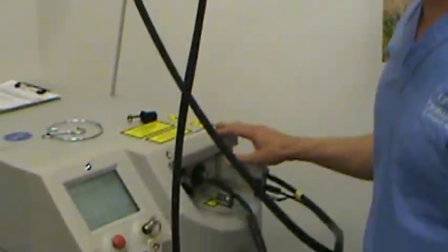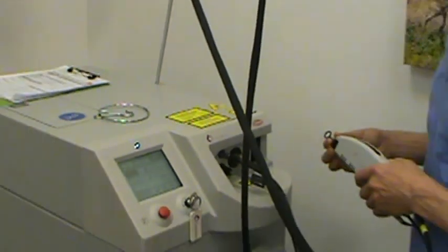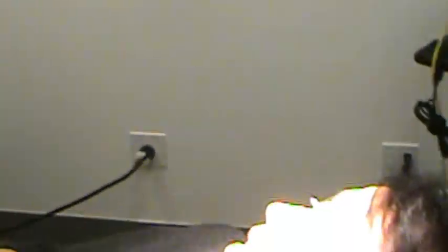Now we're just calibrating the laser for those settings I just discussed. The patient's a little nervous, but it's really not scary — it'll just be a little bit of discomfort.